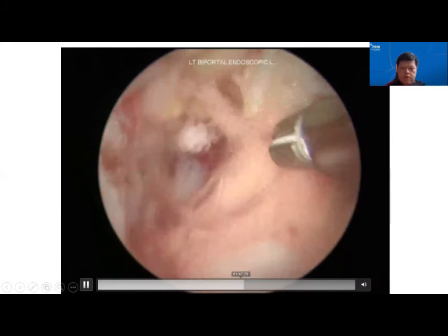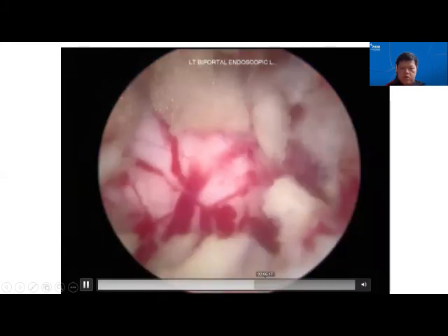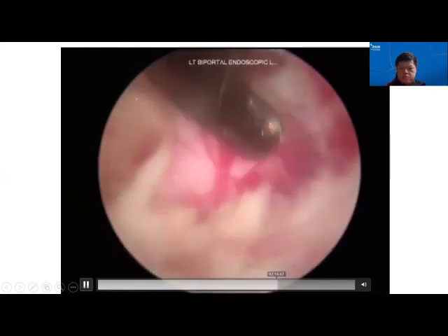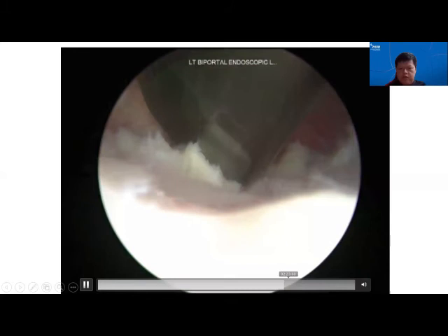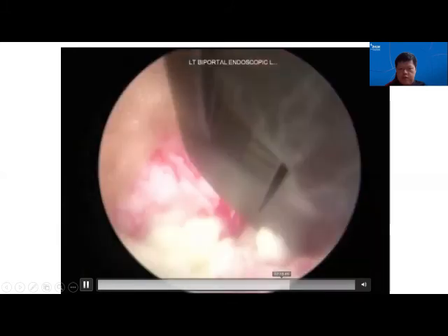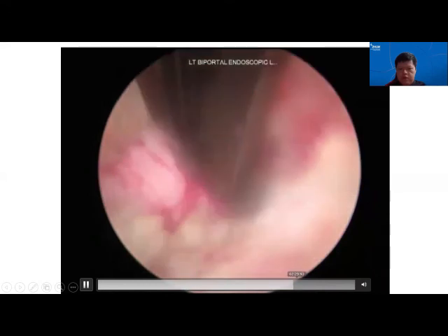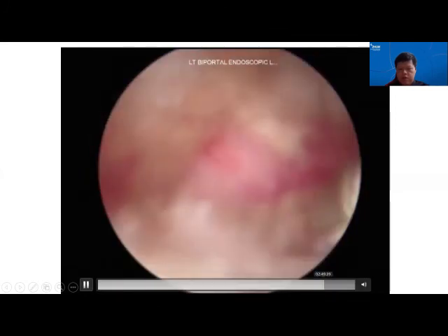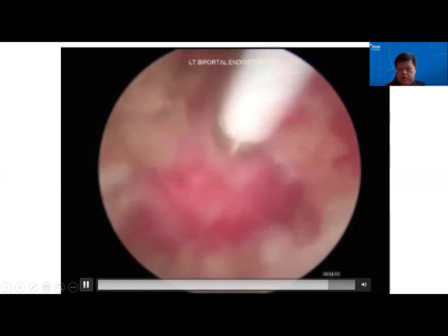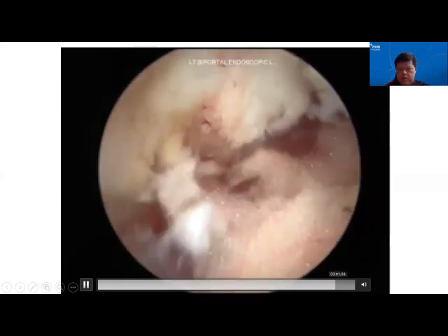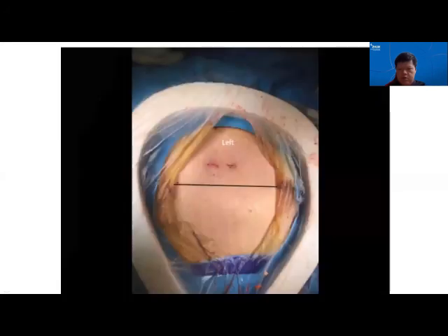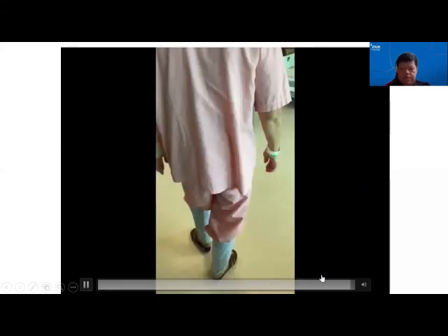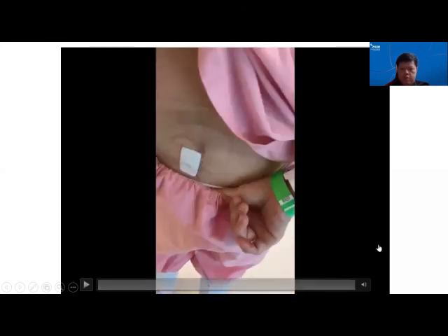I like to do the contralateral side first before resecting the ligamentum flavum. Once the contralateral laminotomy was completed, I then addressed the flavum. The ipsilateral flavum was exposed with the dura visible, and the contralateral flavum was removed using a Kerrison rongeur. We then exposed the dorsal aspect of the flavum to perform decompression, visualizing the traversing and exiting nerve roots on both the ipsilateral and contralateral sides, and resecting just enough facet joint to see the traversing nerve root. In the end, the patient had two small wounds and was able to walk within a few hours of surgery, discharged the next day — currently one month out with no symptoms, VAS zero and ODI zero.